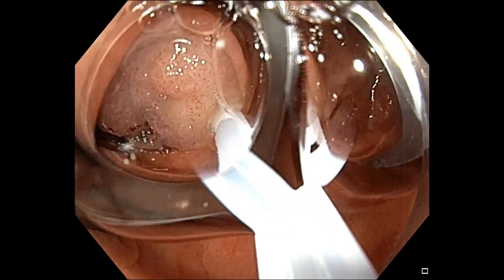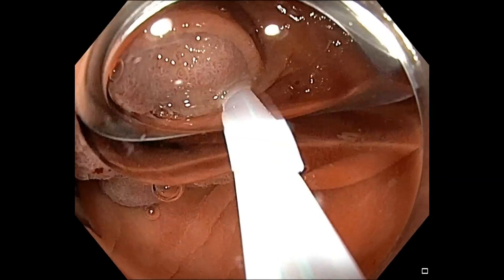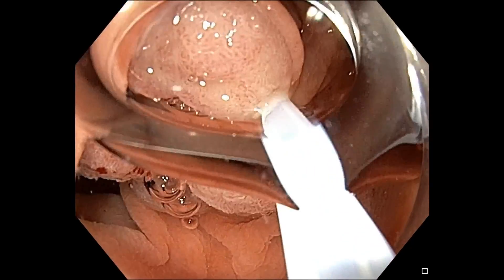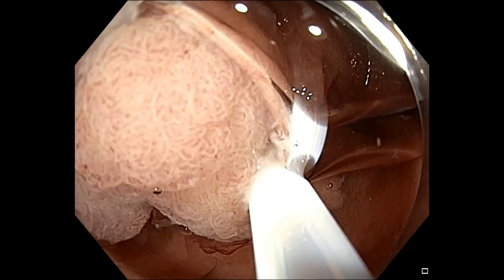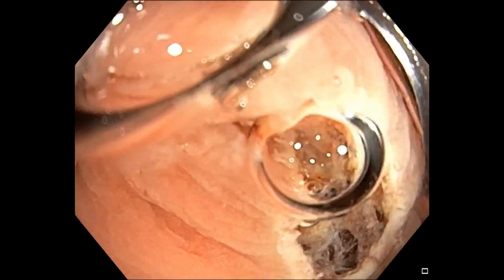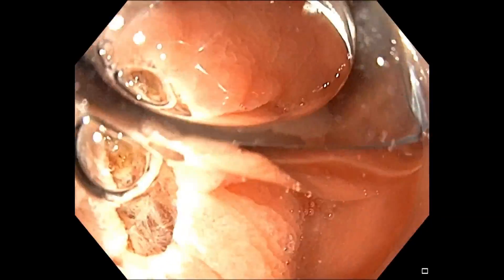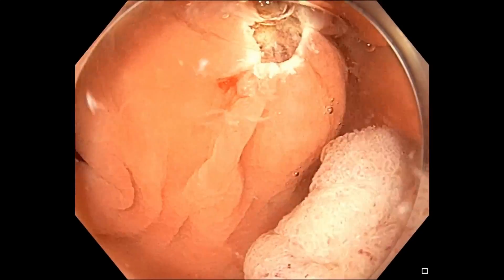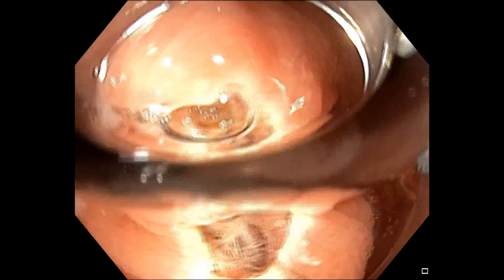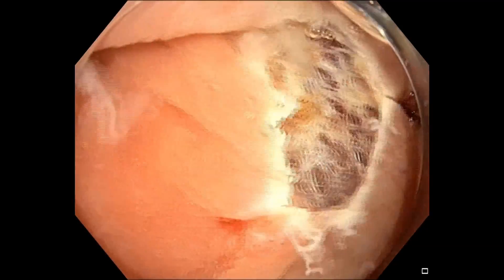Due to the fact that we don't inject, the size of the polyp will not increase, and you can resect even this lesion in one piece. As you can see, the resected area is not as big as we expected from a 2.5 centimeter polyp, so it looks very nice and there is no risk of perforation.